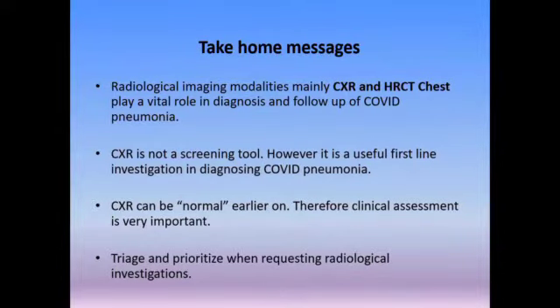Some of the take-home messages I would like to say: chest X-ray and high-resolution CT play a vital role in the diagnostic workup of these patients as well as follow-up. And chest X-ray is not a screening tool, therefore you have to take into account the clinical condition and request when necessary. However, it can be a very useful first-line investigation.